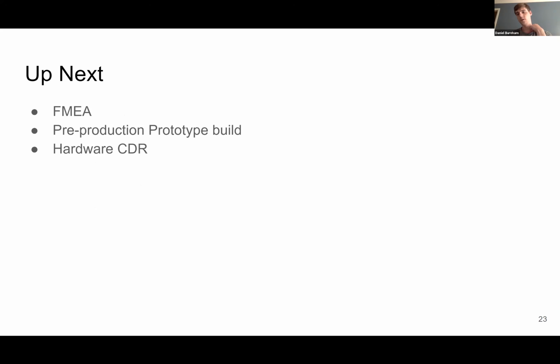Yeah, so you can put it in the risk quality if you identify one, or engineering. I'll keep up with both of those. The FMEA we can use for development, but that's not actually compliant with the standard we have to use for medical devices. So I'm actually translating all that into a 14971 risk document.